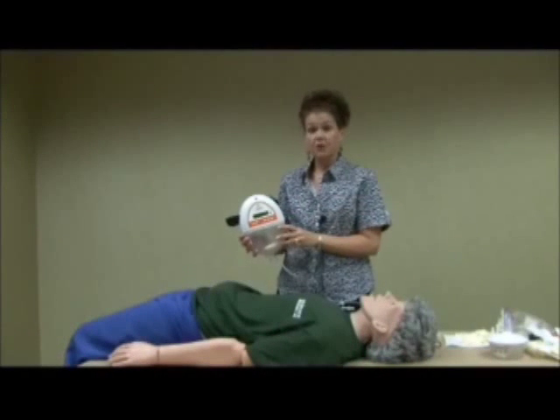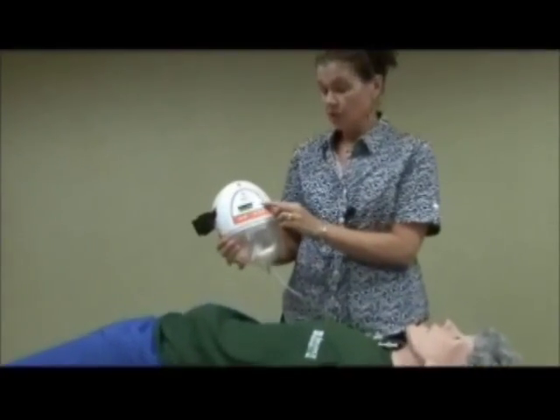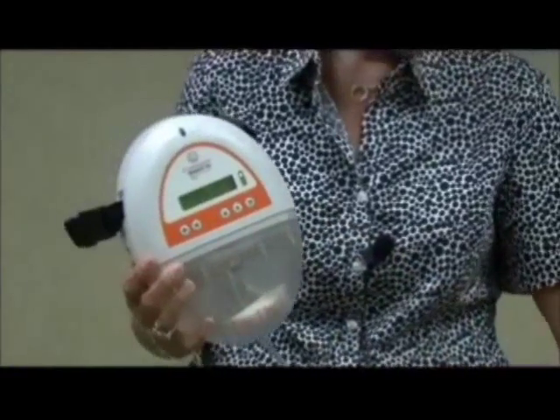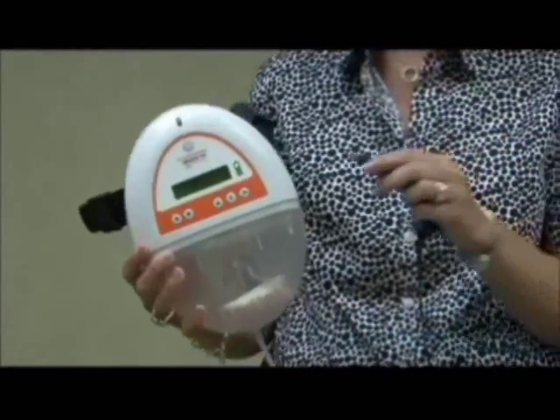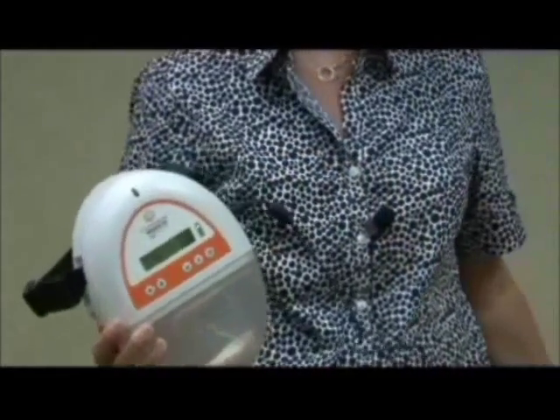Should your machine read low battery, you'll notice that it will read low battery on the screen, and you'll notice an amber light in the battery symbol. You'll need to plug your machine up to the battery pack that's provided with your equipment here in the side of the machine and into your wall outlet.